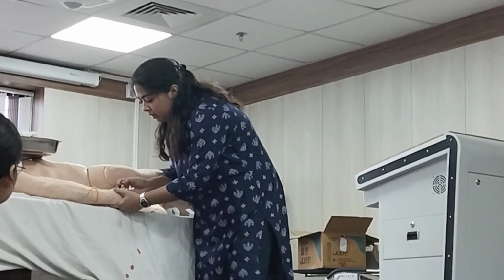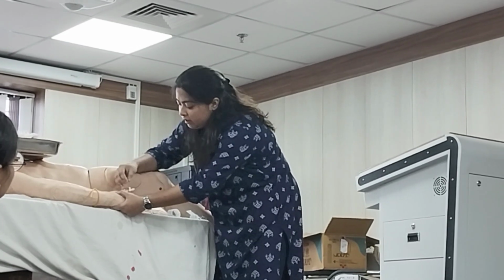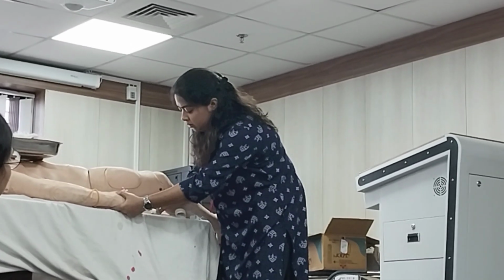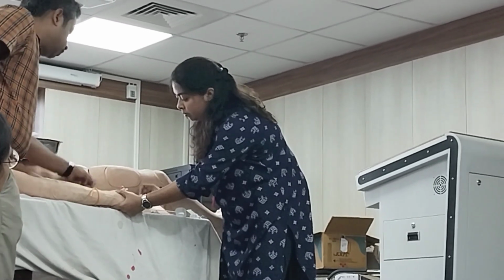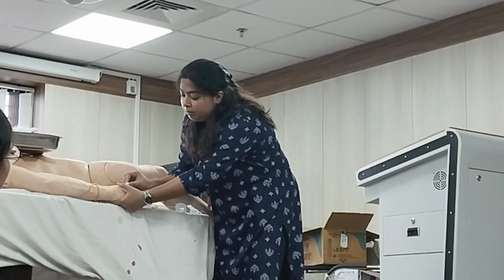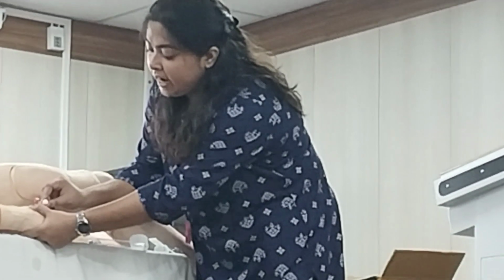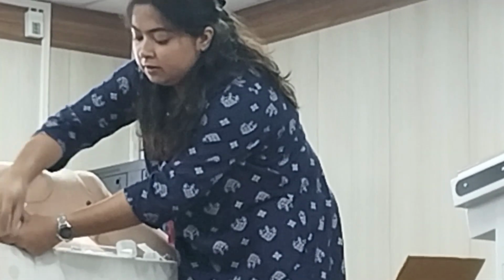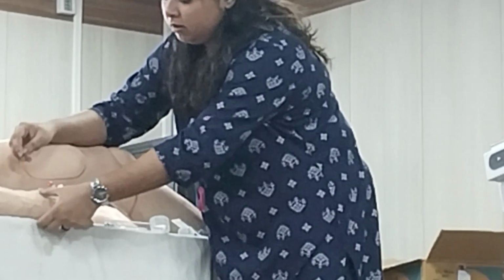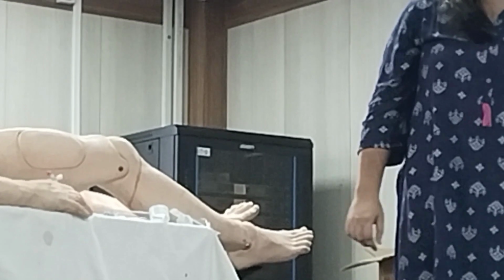Okay, and obviously your tourniquet is here. You keep the hand over here, then you take out the needle, and then you put a cap. You put your hand over the vein, over the cannula, and take out your tourniquet, so that the blood will not come. Okay. This is how you will do a cannula.